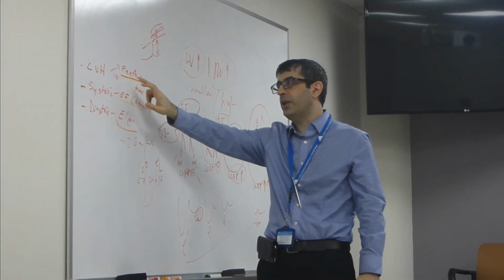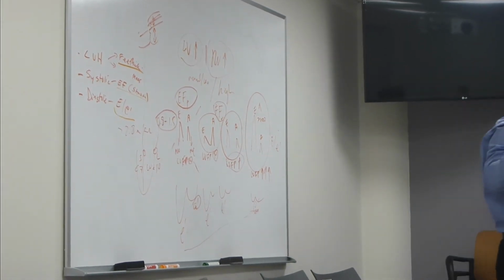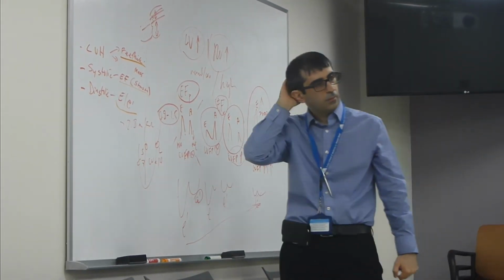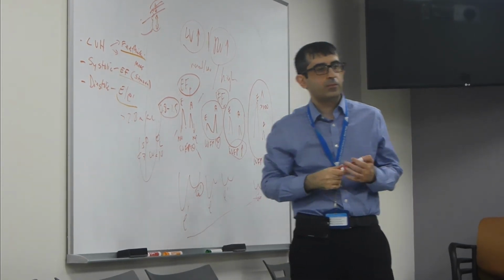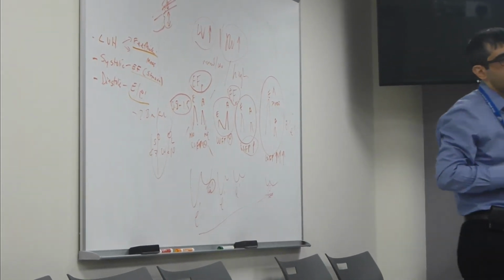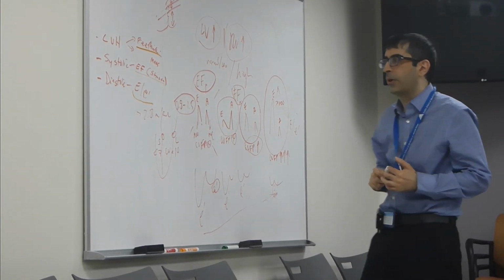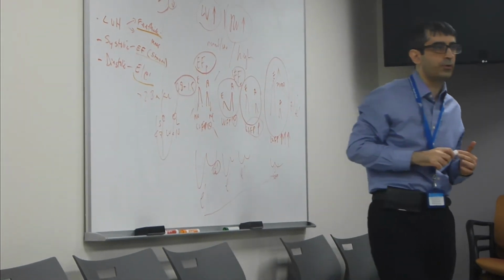So with LVH, do you want to measure the septum and the posterior wall, or just the posterior wall? I would say what the most standard thing would be. I've seen some that describe looking at the LV free wall in diastole, as that would be a single measurement. But there are two ways to do it, right? Some people say you measure both, and then you report both.